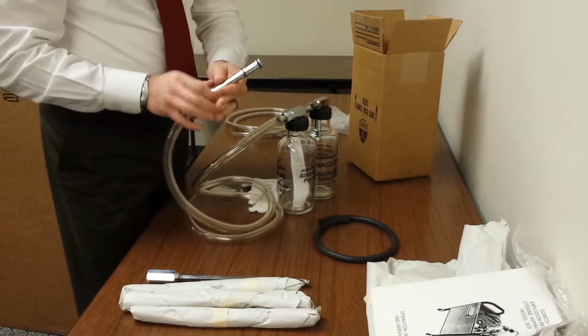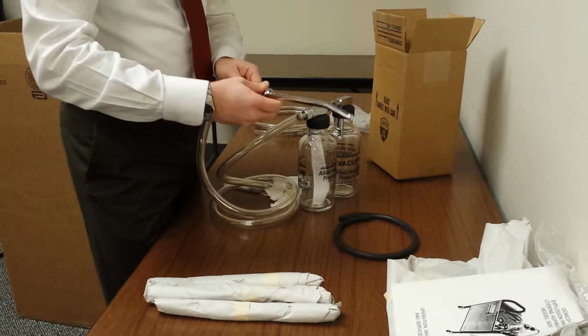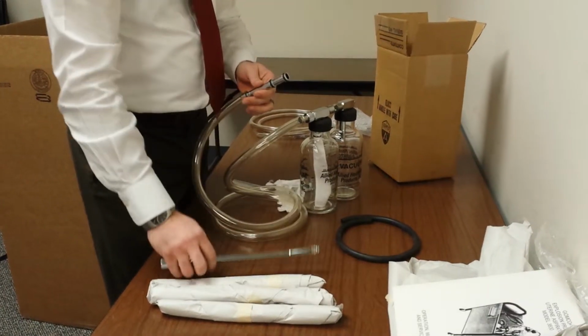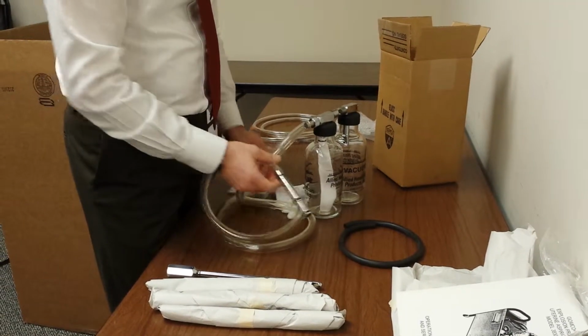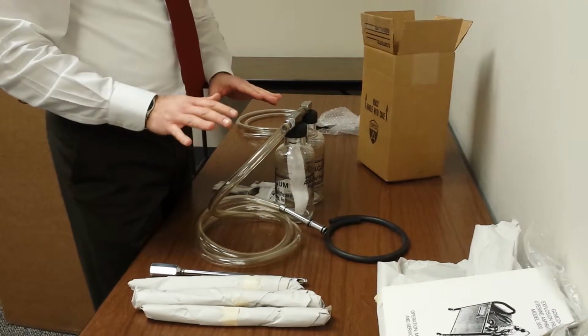I'm not putting them all the way on, but you put them all the way on, and then you'll see that the curette will simply slide on and secure firmly, and that can be slid off and you can use the other curette sizes. So that is the basic reusable hose assembly.